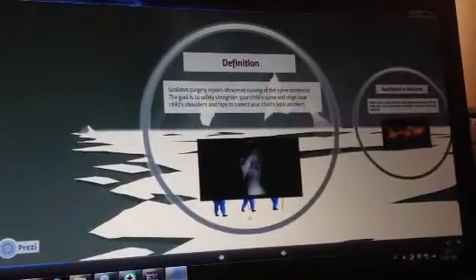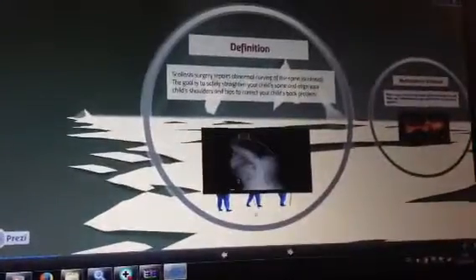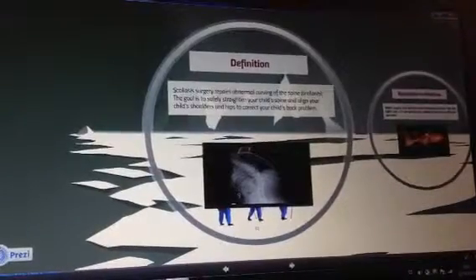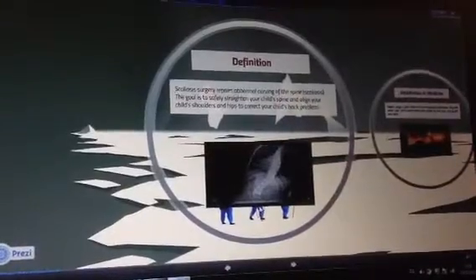You can see that the lateral X-ray shows a significant hypokyphosis, or loss of kyphosis, which is typical of idiopathic curvatures. You can see the lumbar compensatory curvature is highly flexible, and this allows us to do a selective thoracic fusion in this case, the thoracic curvature being this.